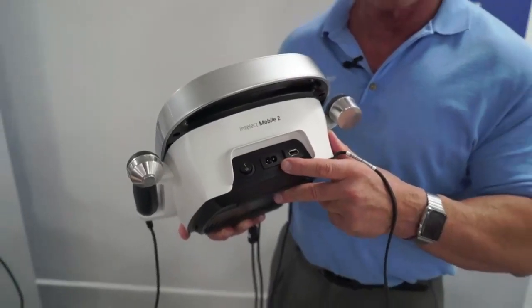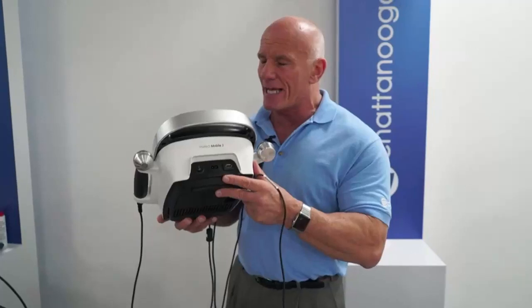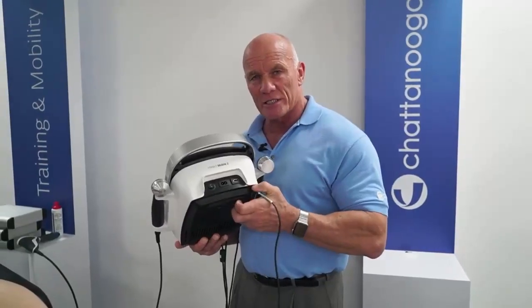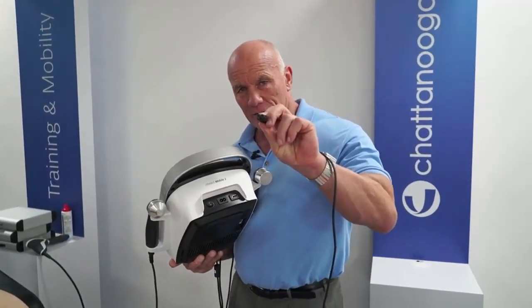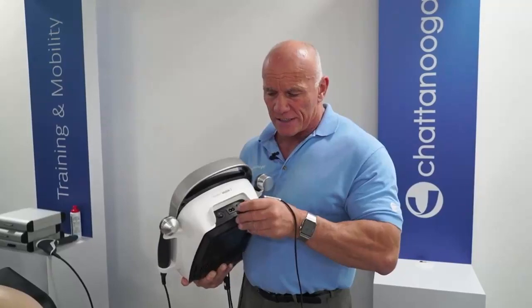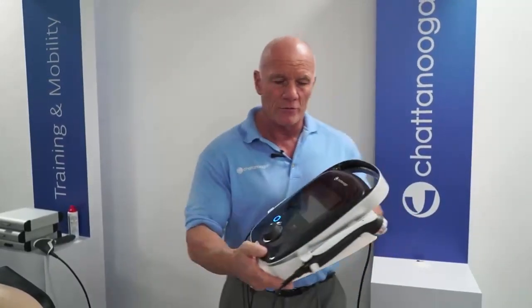The beauty of this new machine, and again, a unique feature to Chattanooga, is the earth is built into the machine. So we are the only manufacturer that's allowed to use these 2-pin plugs. So this is the only portable ultrasound that you're allowed to use in patients' homes now.